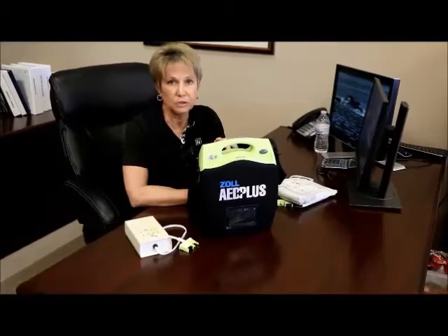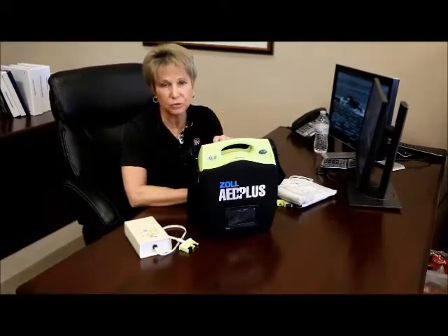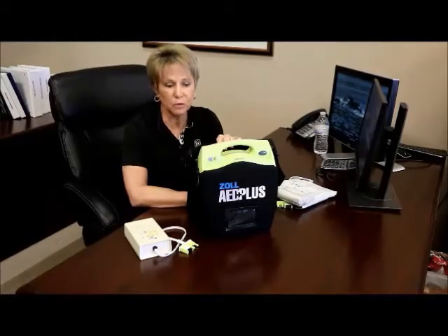Hi Jonathan. This is Leslie Roberts with Ultra Medical. Thank you for taking the time to do the inspections for American Greetings and also do the training. I wanted to run through quickly how to do the inspections on this AED. I'm sure you're familiar with them, but there are some specific things that we're looking for.